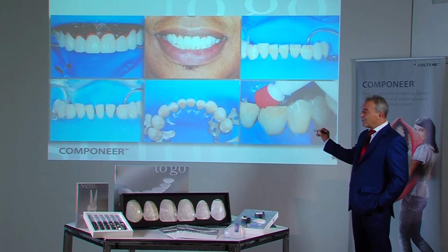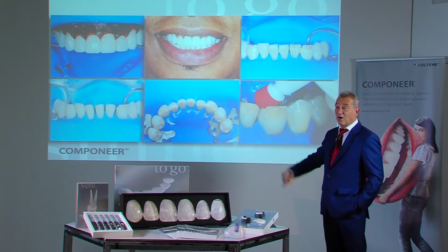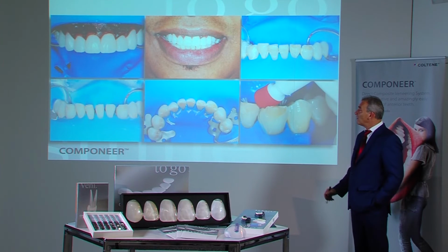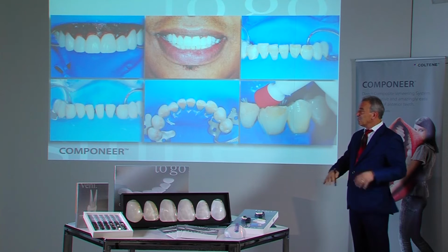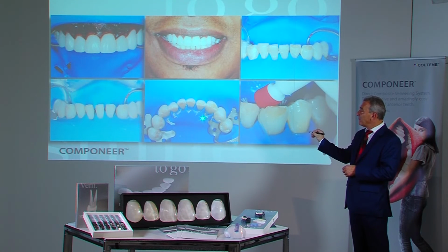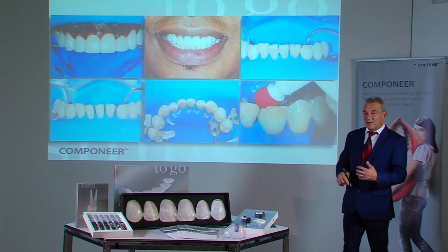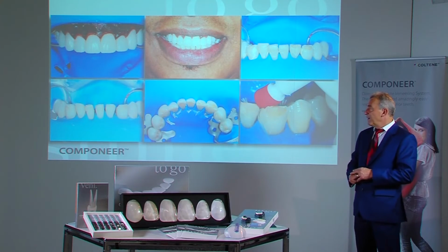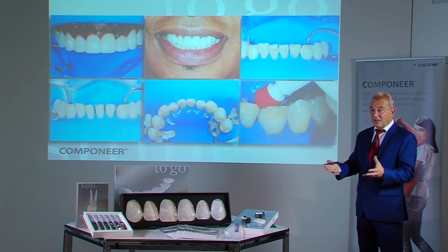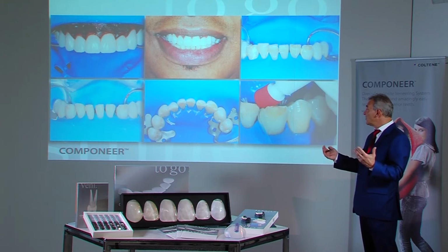Here, a different rubber dam technique was employed. The rubber dam was glued to the gingiva in the maxilla. Gluing in the mandible is often not that easy, as one does not need the contour of the gingiva. It was decided to knot the ligatures lingually and hold the rubber dam down buccally. Of course, this only works if the teeth are tapered downwards. If we have the wrong tooth shape without equator or cervical cincture, then this will not work.